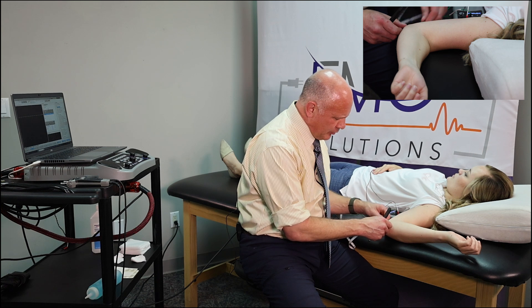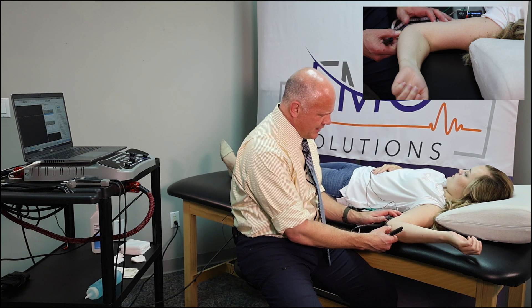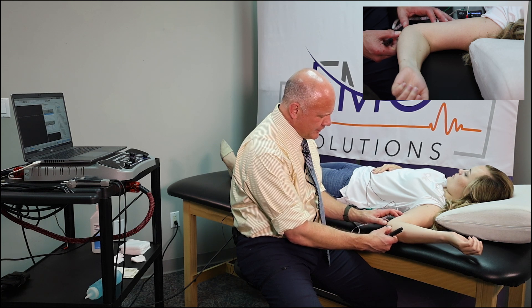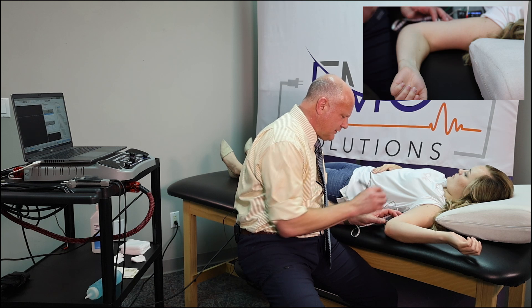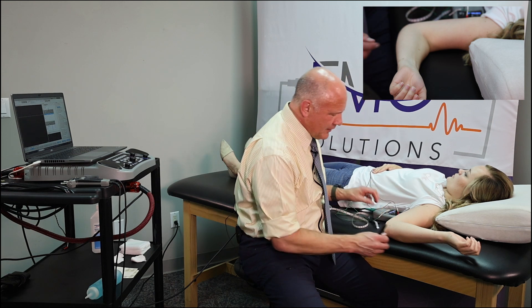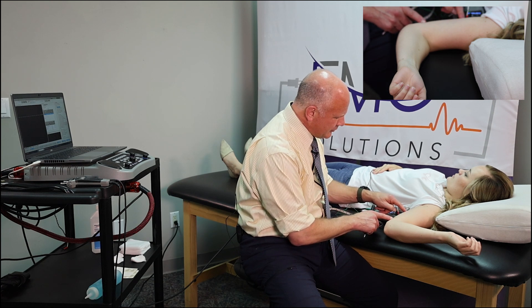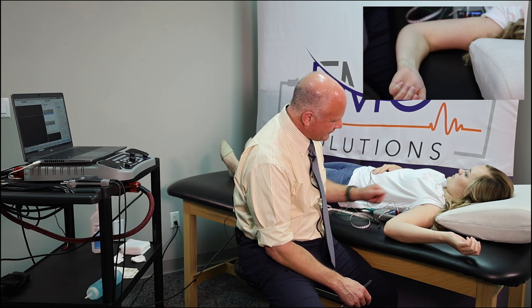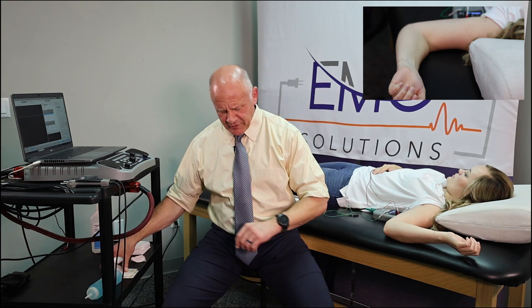I'll put a mark right there. In her case this is 18 centimeters. I want to make sure that I go around the elbow — it comes through the cubital tunnel and behind the medial epicondyle, almost like a check mark as it comes behind there. I'll mark it 10 centimeters, then come up the arm another 10 centimeters. So we've got an 18-centimeter segment, a 10-centimeter segment coming behind the elbow, and another 10-centimeter segment up into the arm toward the axilla. Our marks are done.